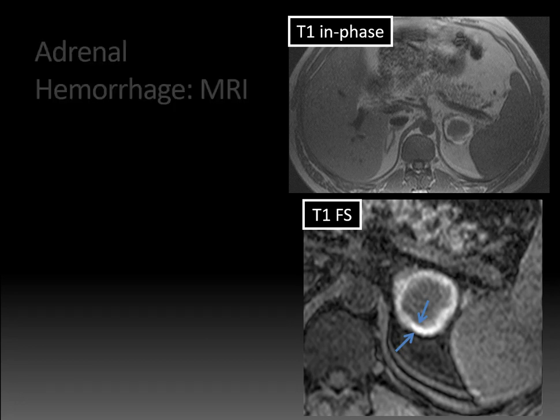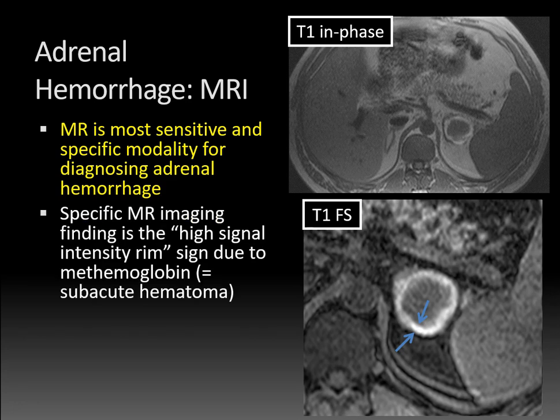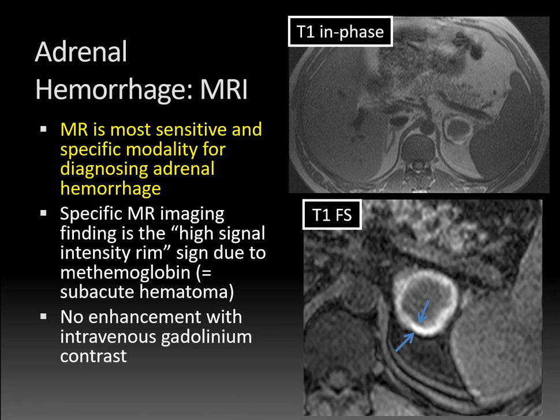This is a very classic appearance for adrenal hemorrhage on MRI. MRI is actually the most sensitive and specific modality for diagnosing adrenal hemorrhage. This specific MRI imaging finding is the high signal intensity rim sign, which is due to the presence of methemoglobin — a form of hemoglobin we tend to see in the setting of a subacute hematoma. And if we gave contrast, just like on CT scan, there would be no enhancement.